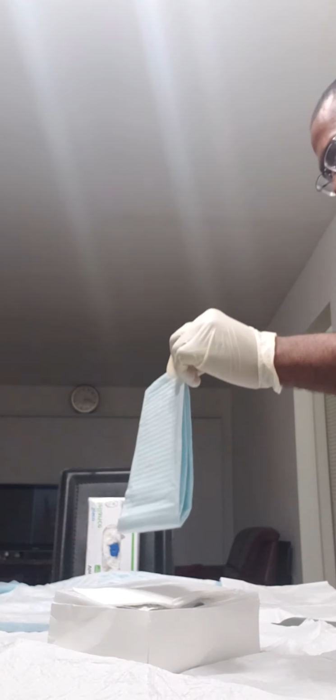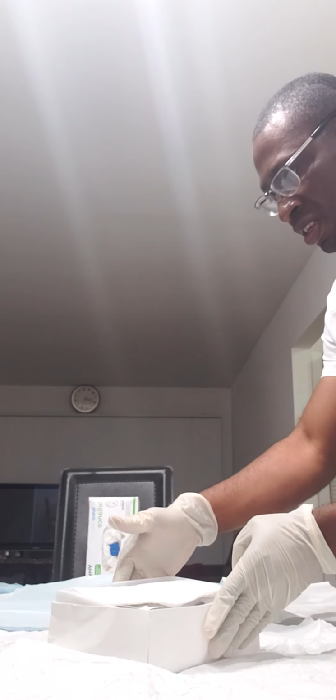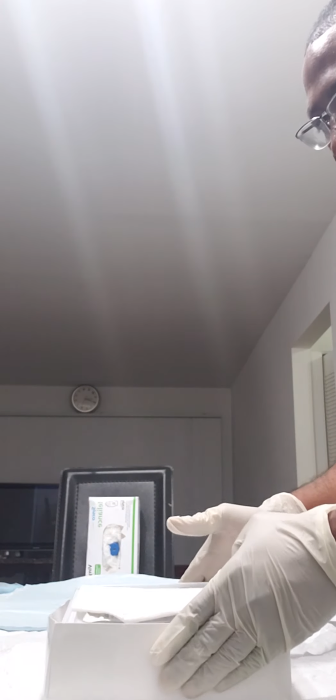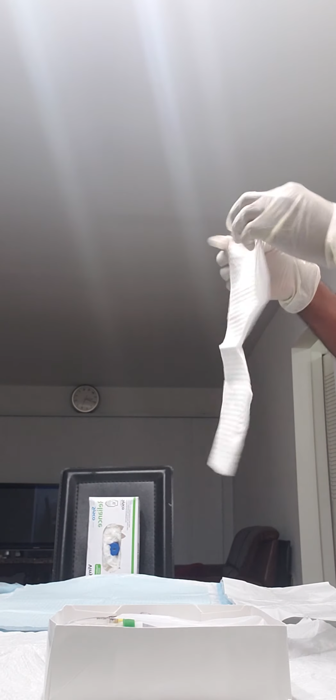All right. Okay, get this out. Go back, open it, and make sure the gauze part is facing me. And I'm going to go to my patient, fan-fold it to the leg. Good. Go back. Get this. Adjust it here. Make sure it doesn't contaminate the borderline. Okay. Take this up. Open it. Get this out. Yes, this is for male patients for extra coverage from contamination. I'm not using it.